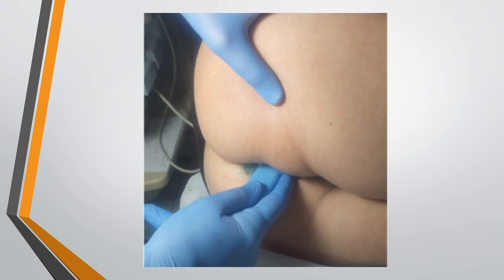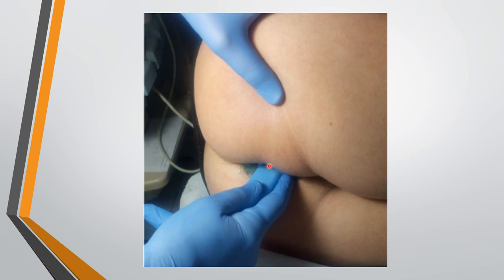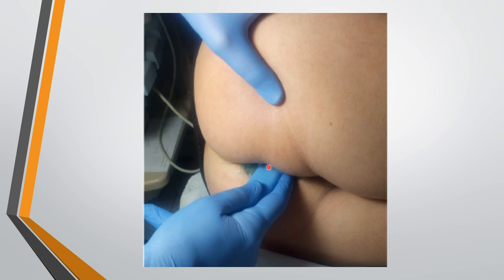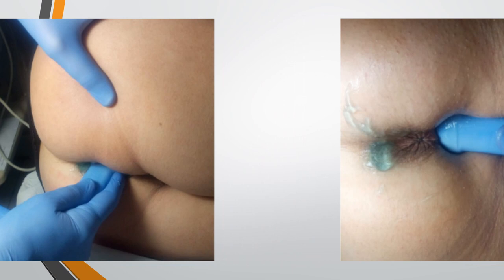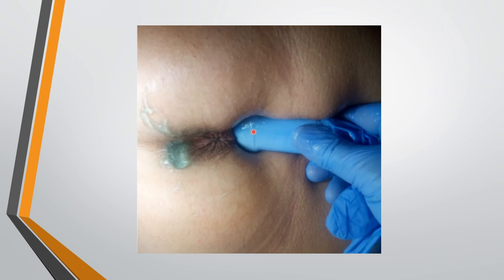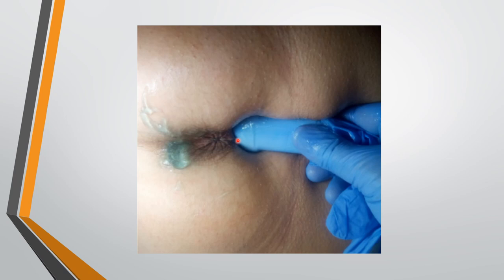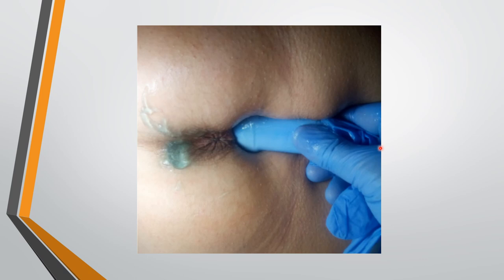The technique is demonstrated here with the patient in the left lateral position. The linear probe is kept on the anal opening and the anal canal is screened in sagittal and parasagittal sections to look for any abscess or fistula. For axial imaging, keep the probe on the perineum at the 12 o'clock position just above the anal canal and scan axially to look for any abscess and whether it communicates with the anal canal.